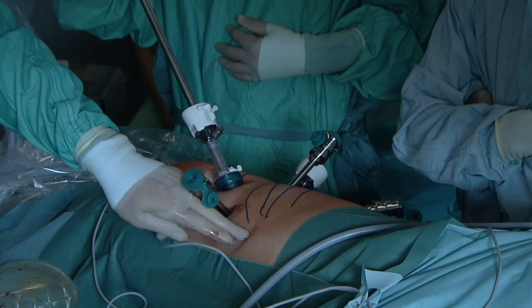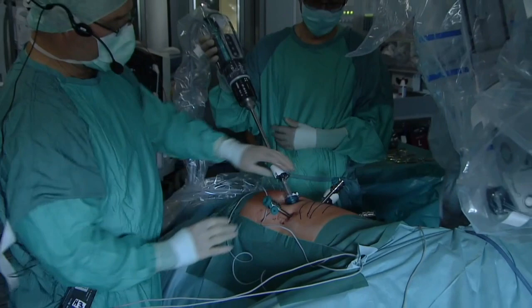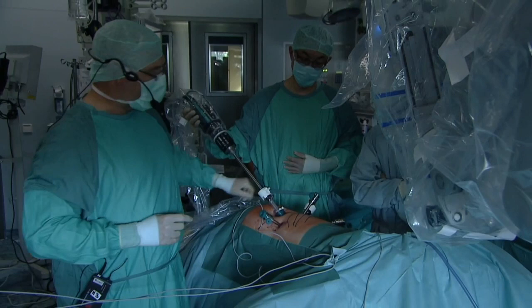The erector spinae muscle is here. The 12th rib is here. Just in the angle there is my 8-millimeter robotic posterior port. Through this port, I used a laparoscopic instrument to push the peritoneum off anteriorly, and by doing that, I created space for two additional robotic ports. So I actually have a four-arm robotic approach today, and that's very nice because I'll be able to retract the kidney.